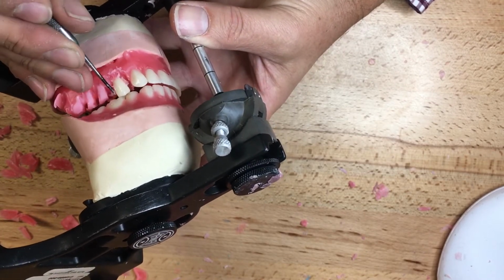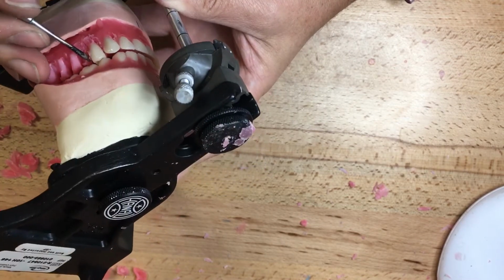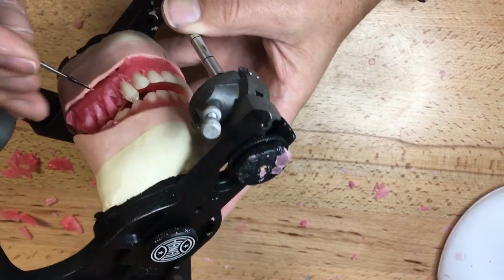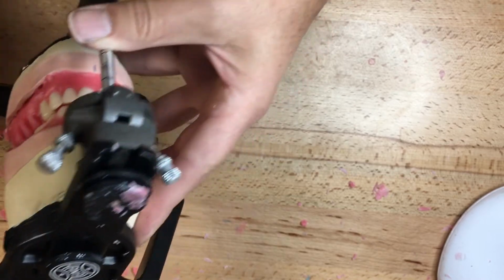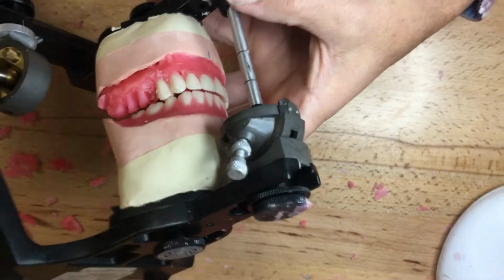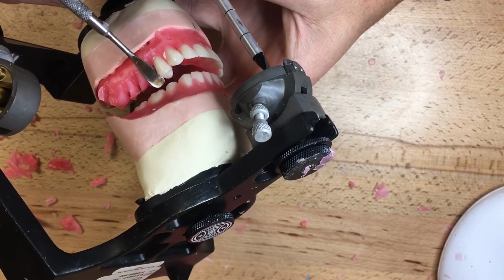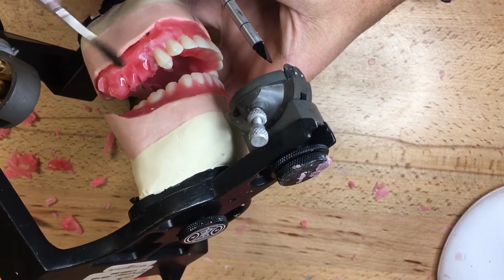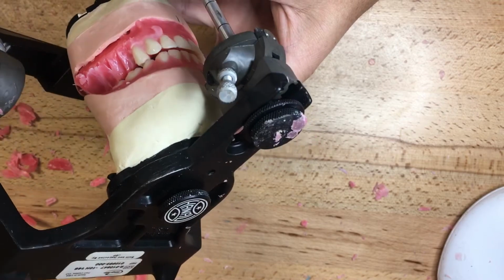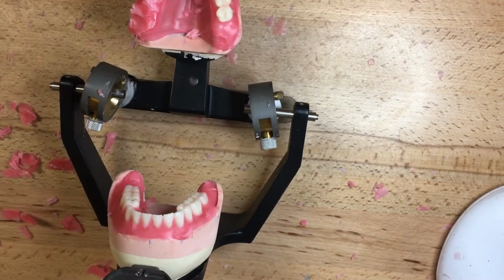It's not back here like a class 1. Now some of you, when we did the class 2 setup, made this lingualized occlusion with these teeth by accident. And I said, oh, that's fine. I even closed this diastema up. I just moved my canine in to reduce the overjet. I should not have done that so soon, but I think I'm ready for number 6.